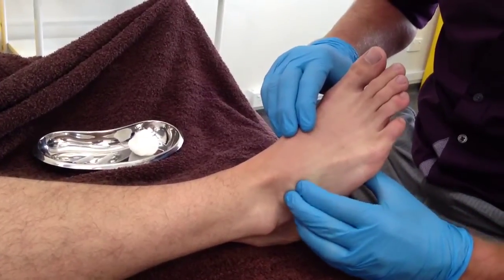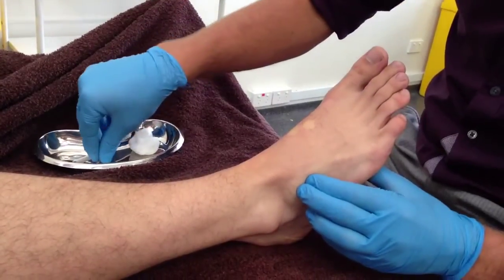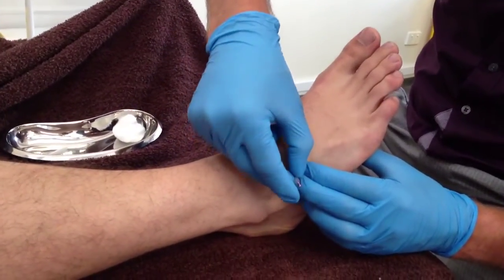Once the trigger points have been located, the needle can be inserted at a perpendicular angle to the skin. Despite using a small 13mm needle, you may still make contact with the underlying lateral tarsal bones.